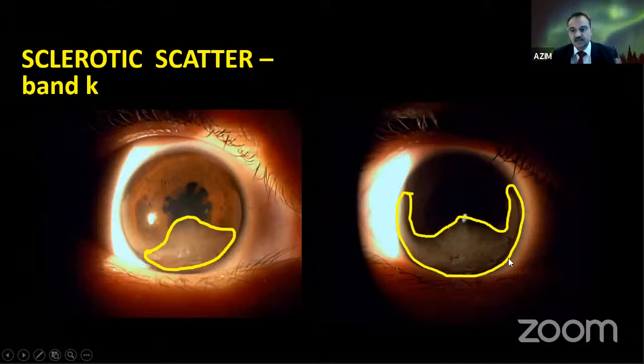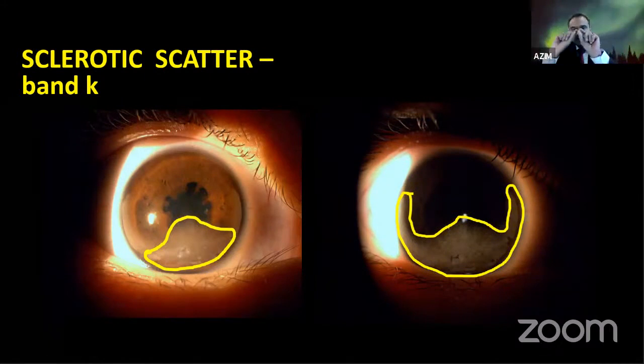How does it work? The cornea is like a clean mirror. You have those fiber optic cables, internet. So the cornea works like a fiber optic cable. When light goes in on one side, it gets internally reflected, goes all the way and exits from the other side. You see, light goes in on this side, exits from this side. When it's traversing here, there's no opacity, it's very clear. When there is an opacity, it reflects back onto your eyes, and that's how you pick it up.